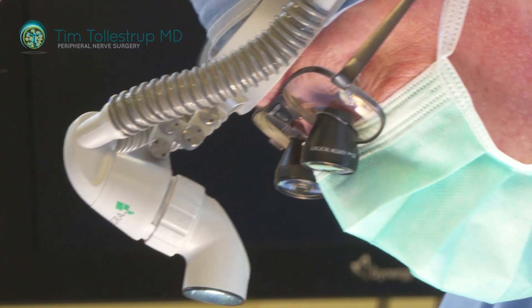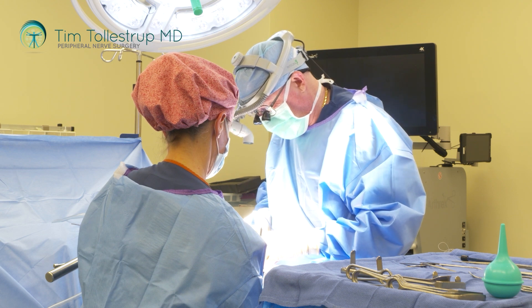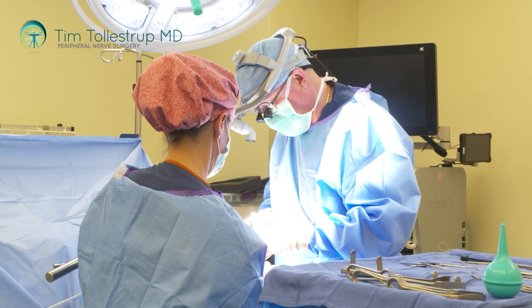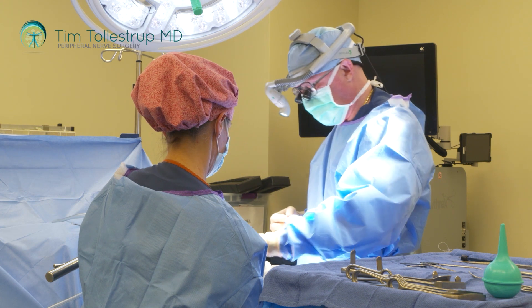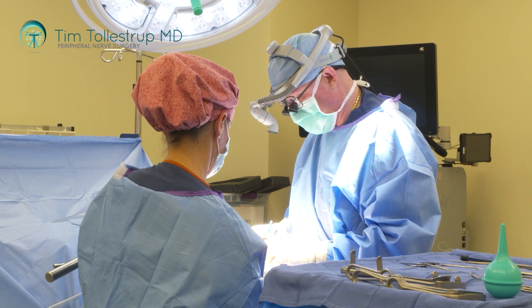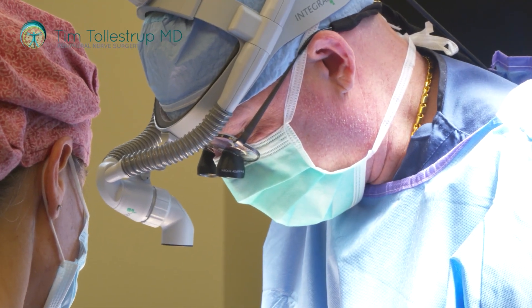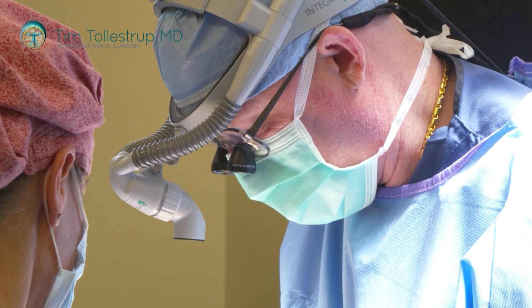Then what you see is just this amorphous layer of adipose tissue — it's just all yellow. So you have to open up this deep pelvic compartment fascia. This is one of the things about this operation when you first start doing it: it's a little intimidating because it's like impossible to see anything. There are big blood vessels down here and other nerves, and you have to get through this fat without injuring any of that. Just feeling the structures helps a lot to keep you knowing where things are and what direction you need to be going.